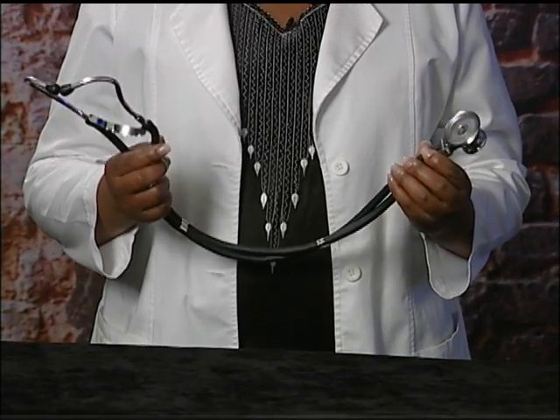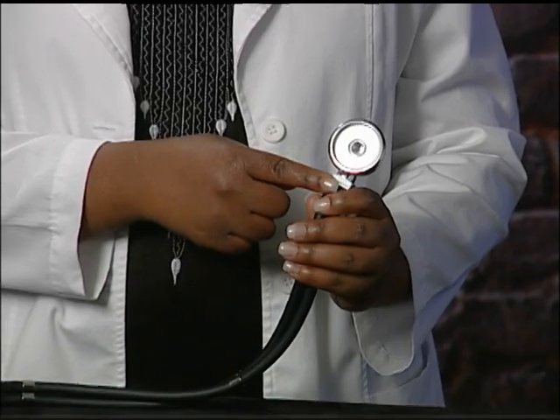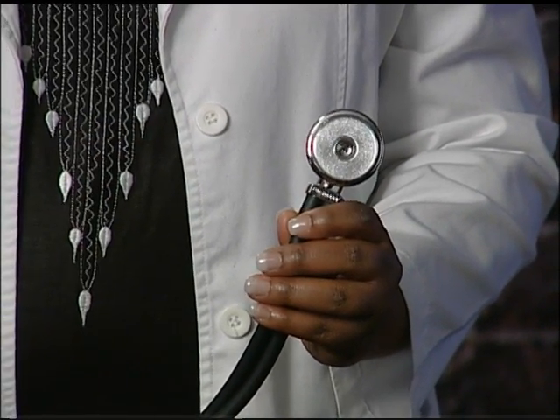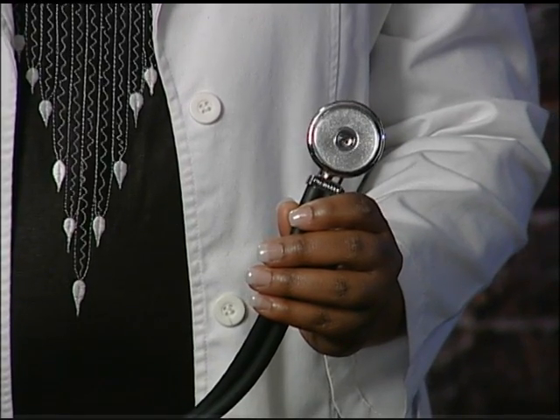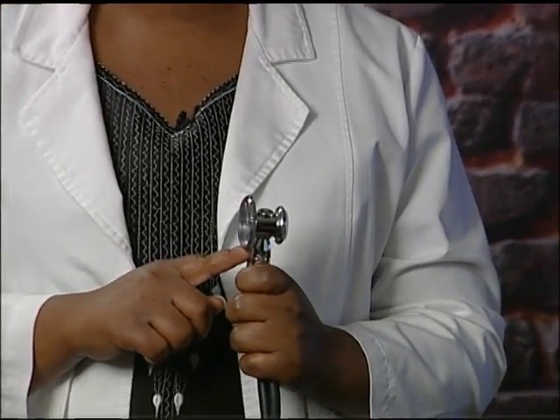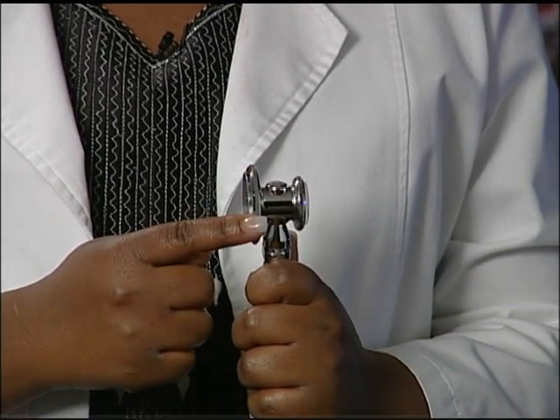This is a stethoscope. At one end is the part which is used to listen to the patient. It can be used to listen to the sounds the heart makes, to the sounds of breathing, or to the sounds for determining blood pressure. This end of the stethoscope may have one or two sides. If you are using the stethoscope with two sides, use the bigger side for taking blood pressure measurements.